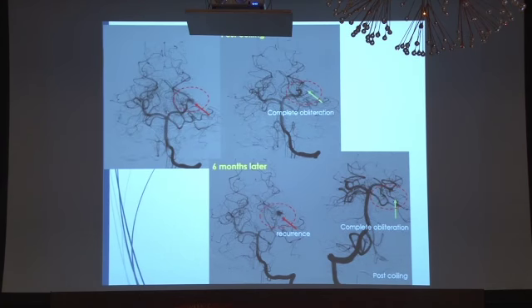The mycotic aneurysm at the left P3 segment was treated by endovascular coiling with complete obliteration. However, refilling of this aneurysm occurred 6 months later after the complete coiling. So we had to add some coils to restore the complete obliteration of the aneurysm.